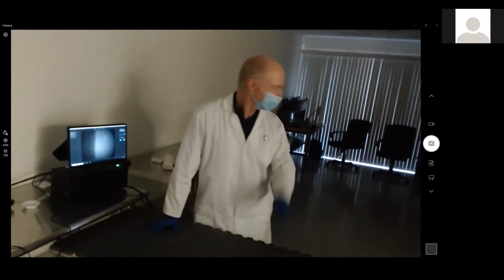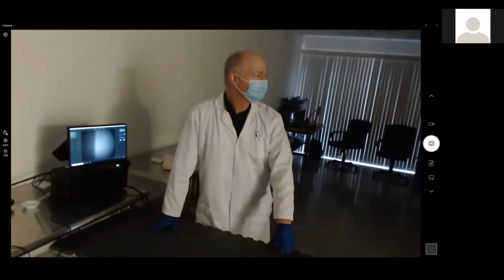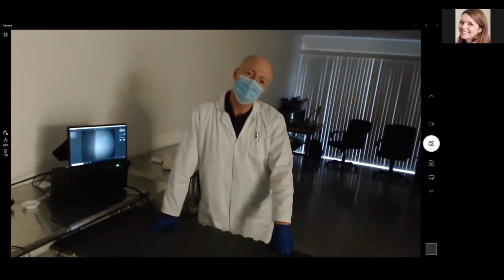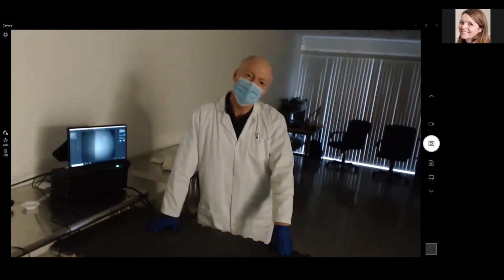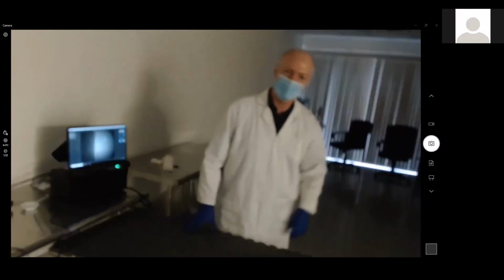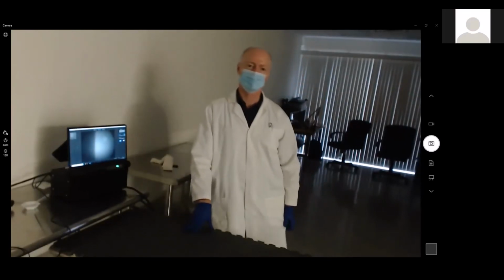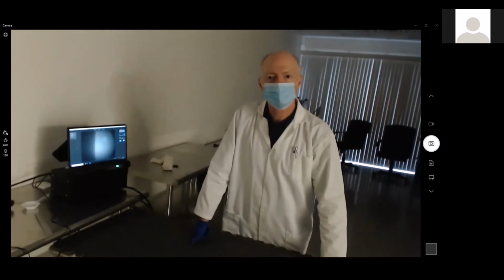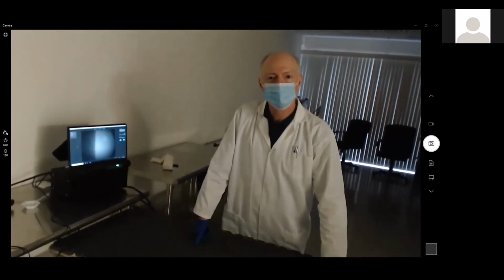Jeremy said he has a specific question about our fundoscope system. Yeah, so Jeremy had a question about your fundoscope system. I think the rodent one. Correct. Specifically, in the system itself, I've been working with it for a bit, and I noticed a few things. First, when you go under measurements, it doesn't give you any units it's measuring by. So I was wondering, what is that supposed to read?